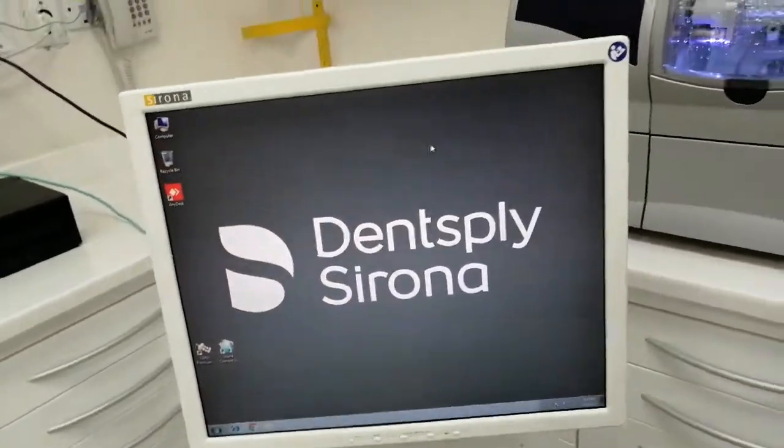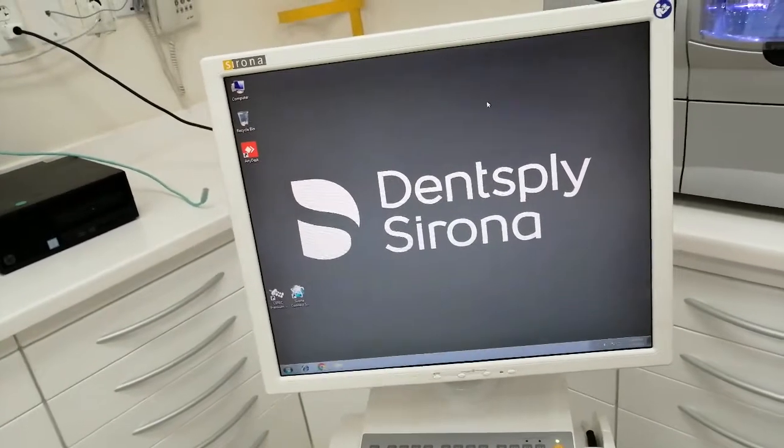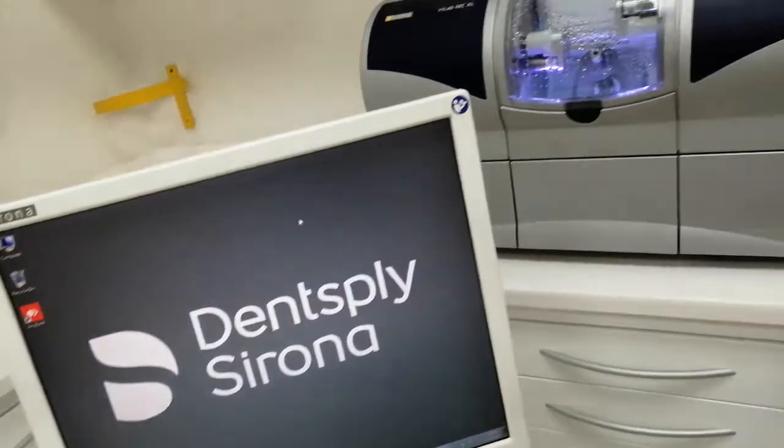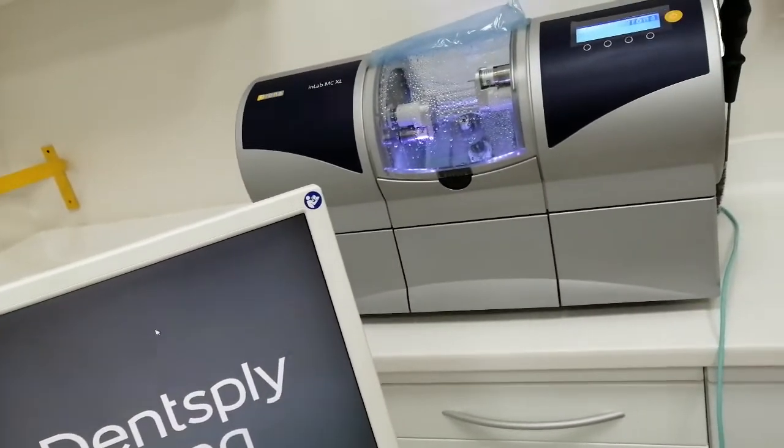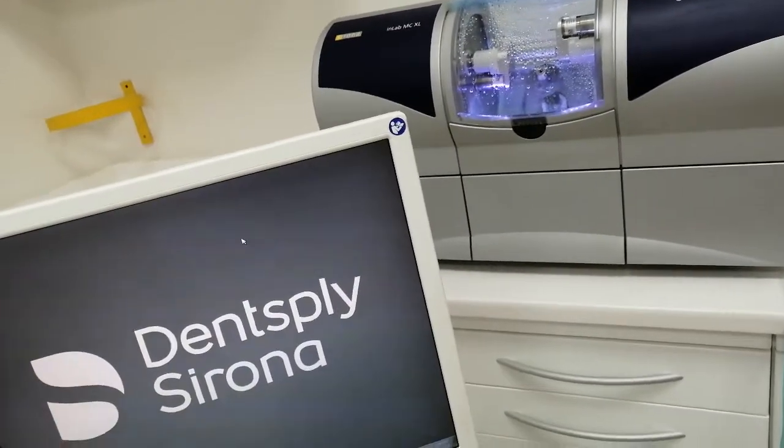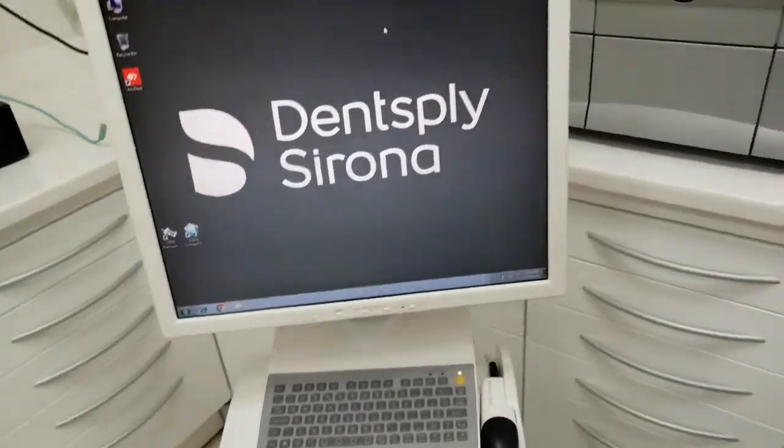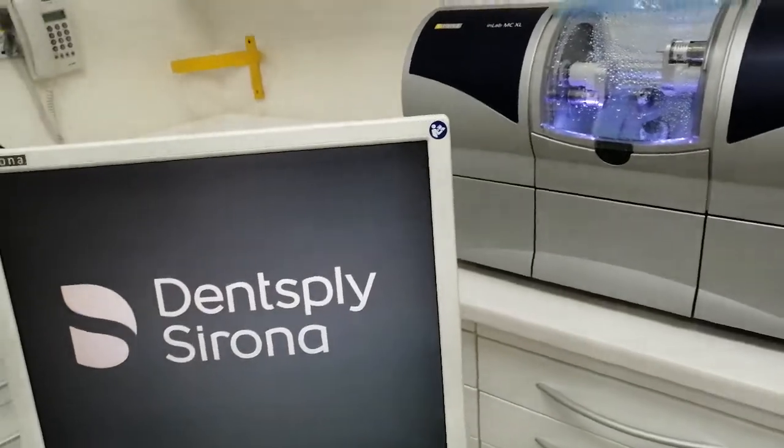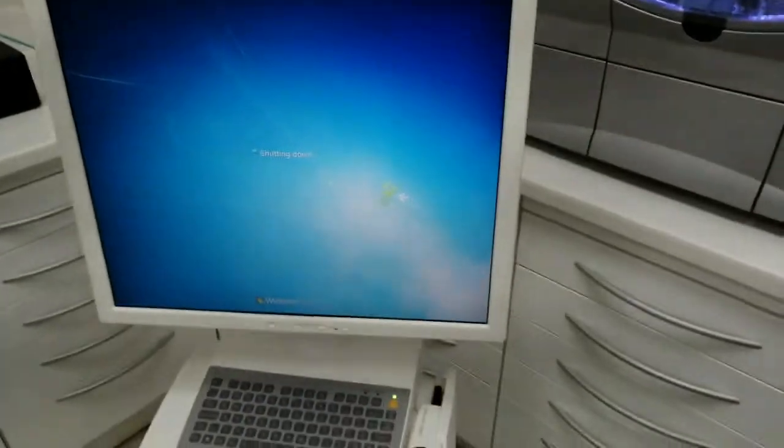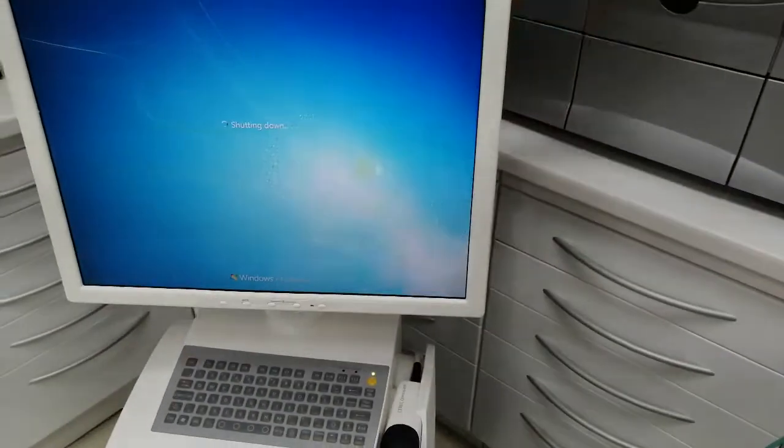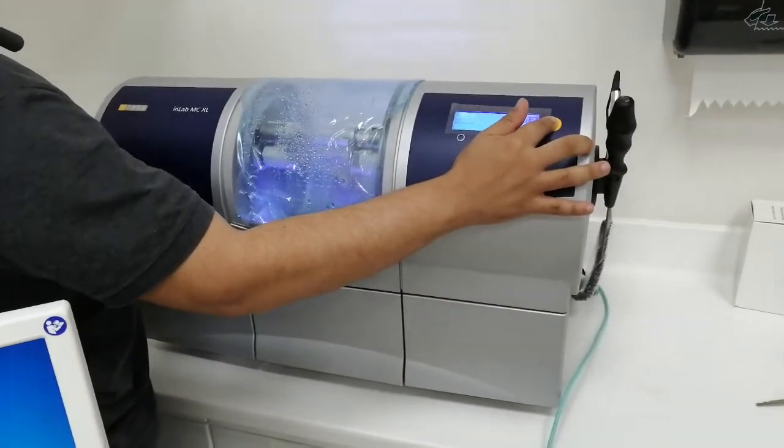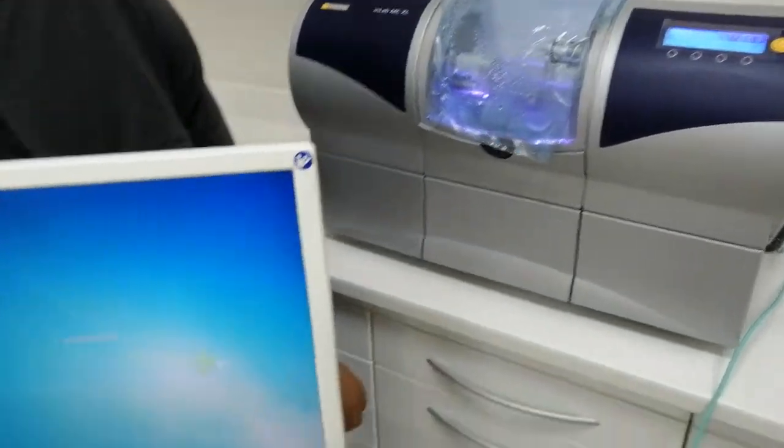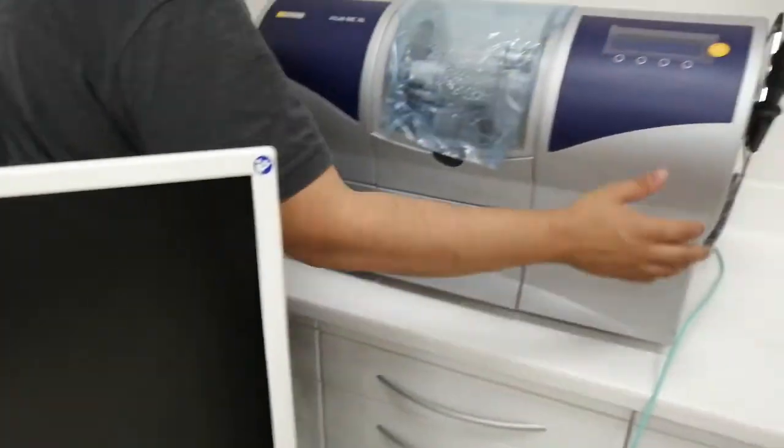This machine is very smart. When you need to change the bars, change the water, or make a calibration, it gives you a message. That's good. Finally, this is an ordinary computer. We can shut down from here. Also we can close the machine from this side. All right, let's go.